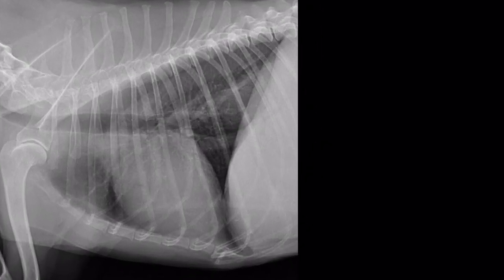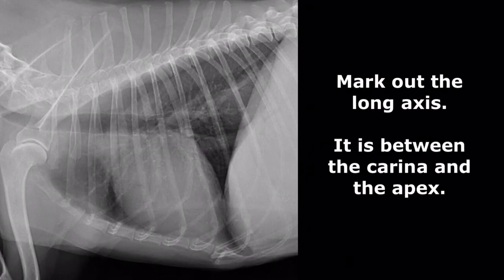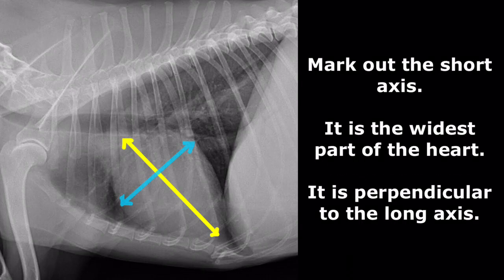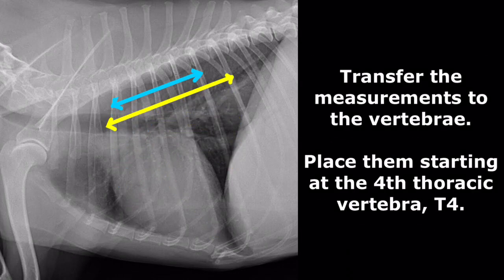On the x-ray, use a ruler or a caliper to measure the long axis of the heart, which is the length between the carina and the apex. Next, measure the short axis of the heart, which is the length of the widest part of the heart and is perpendicular to the long axis. Transfer these two measurements to the vertebrae and place them starting from the 4th thoracic vertebra, T4.